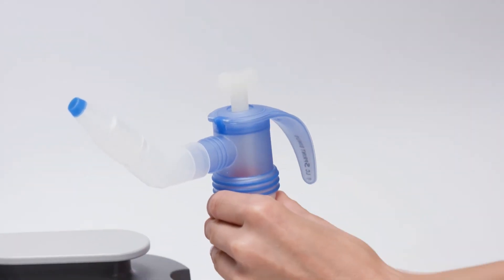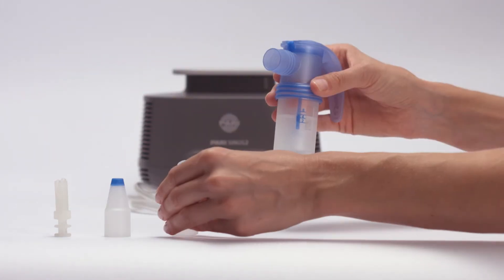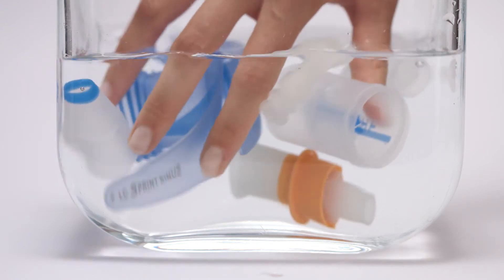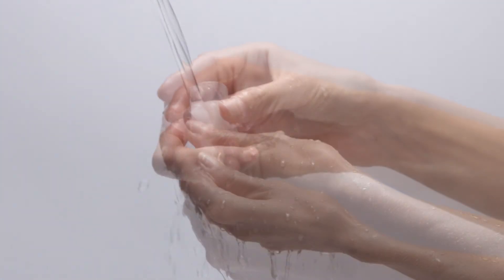For cleaning and disinfection, disconnect the tubes from the nebulizer and disassemble the nebulizer into its individual components. Clean the nebulizer after each use. Wash all individual parts in warm water with dishwashing liquid, before rinsing thoroughly in warm water.